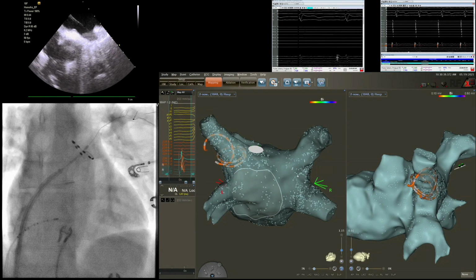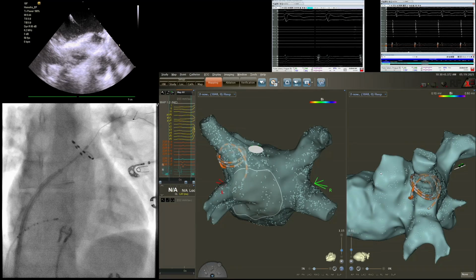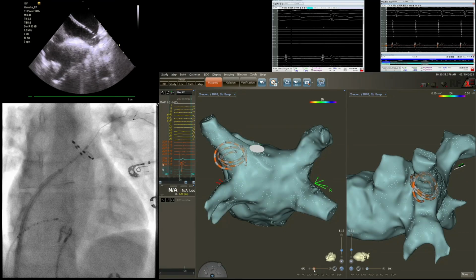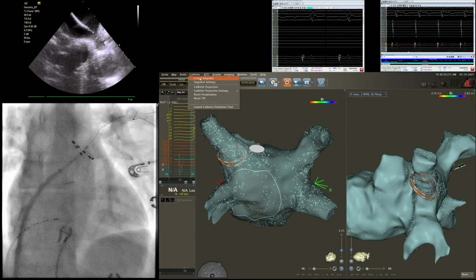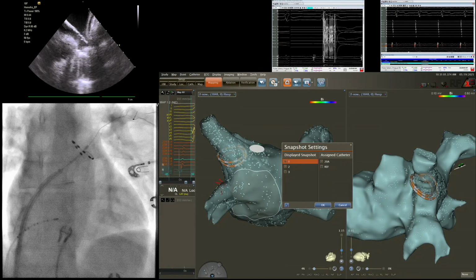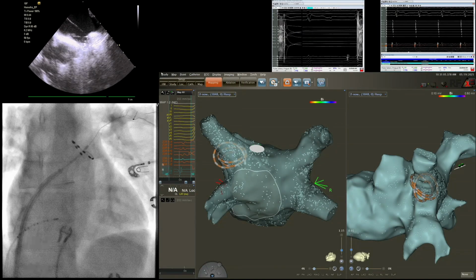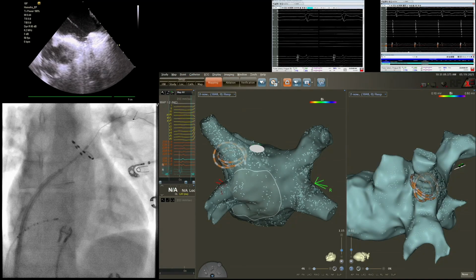Okay. Oh no! Now I jump inside. Yeah, now jump inside. Yep. Sorry. Go back. Okay. Now, okay, so let's go now. Okay. Save it. Shadow, please. Switch off the magnet and let's go. So this is the third series of applications. And if you look at the ICE, it's a really nice visualization.